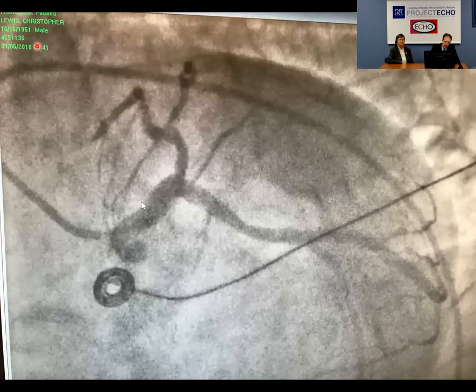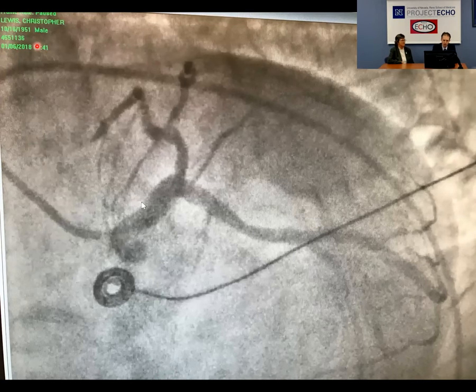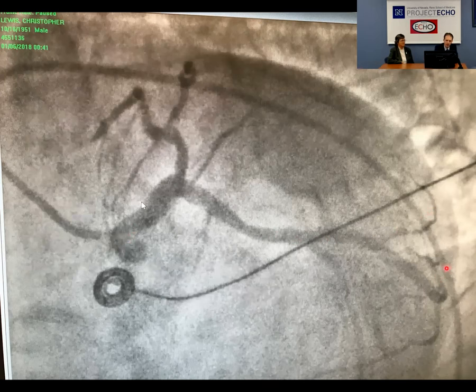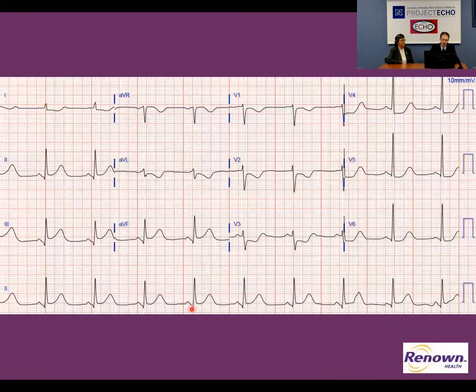This patient was taken emergently to the cath lab. This is a left anterior oblique caudal view — the so-called spider view, because the arteries come out looking like a spider. Here's the left main coronary artery, and here's the left anterior descending, totally blocked off, as you can see. This was an anterior infarct, mid-LAD.